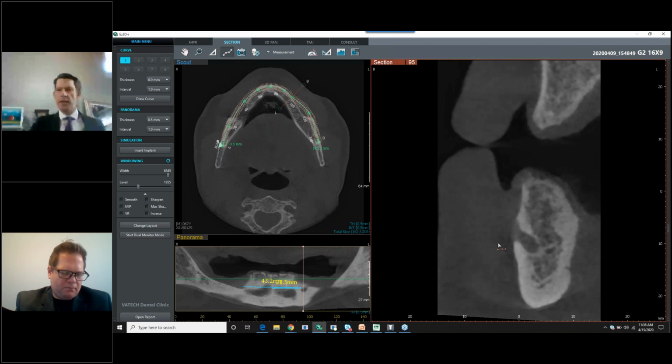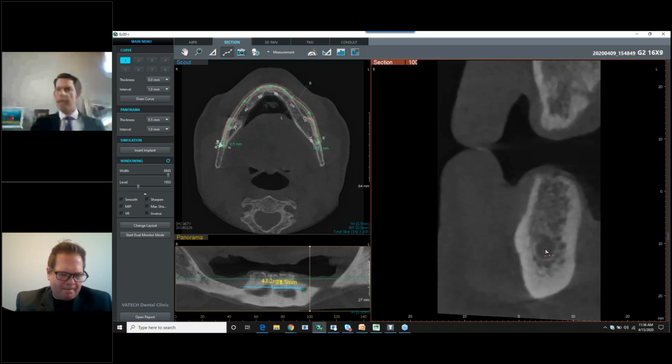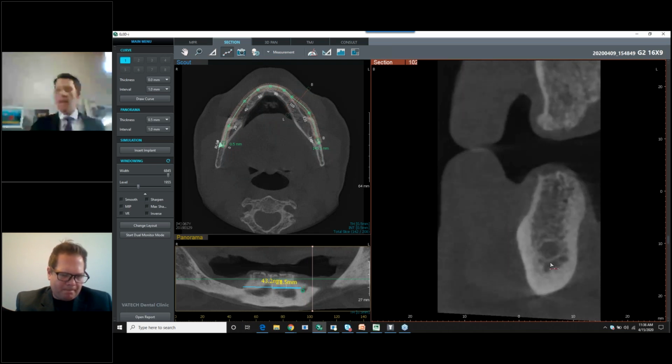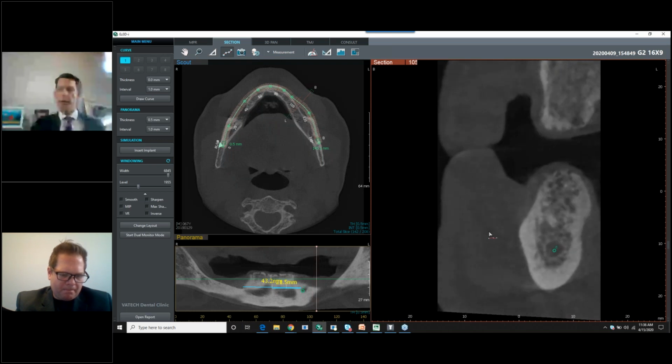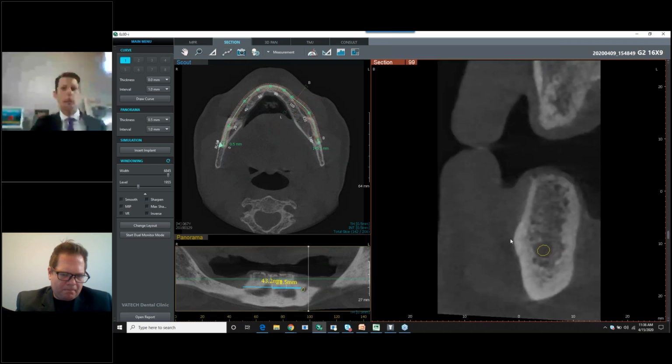If you have questions specifically about tracing the nerve here, we have our video library on our website in our Customer Learning Center. In that Customer Learning Center, we have specific videos on implant planning. We actually also have all of our webinars that we've done, including this one, which will be loaded to that Customer Learning Center. So if you have questions on this or other clinical uses, it's a good, valuable reference to look at.